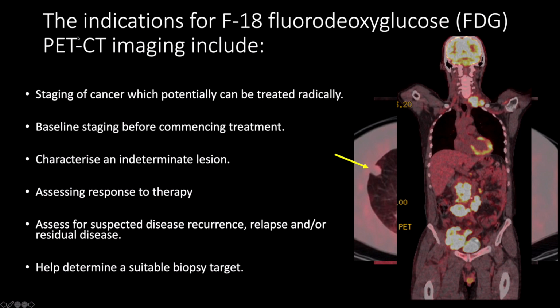So sometimes when you've had treatments, it can be a bit difficult if you see a blob on the CT. Is it truly disease or not? But a PET scan can sometimes help you with that. It's also good for helping identify a suitable biopsy target as well.